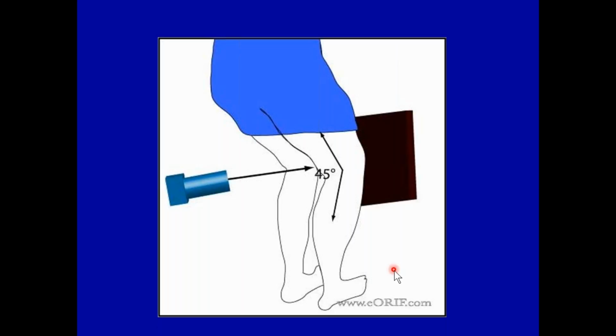Now, the discussion or the challenge you may have is if this is too close to the floor, it may not work. So now can you get your patient up on something? But if they're older, how do you make sure that they are stabilized so that you can use the tube and they are in the anatomic part that you're interested in, in this case, the knee. So you just have to play with it.